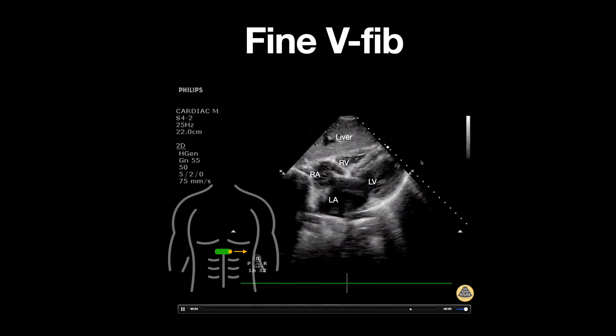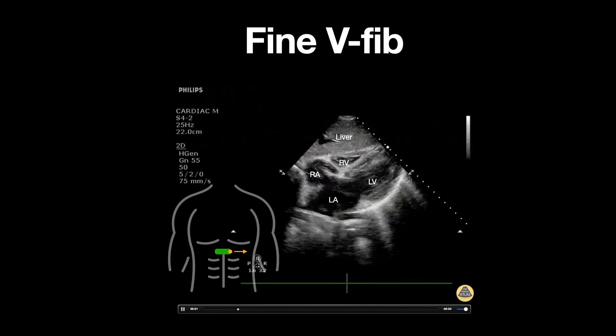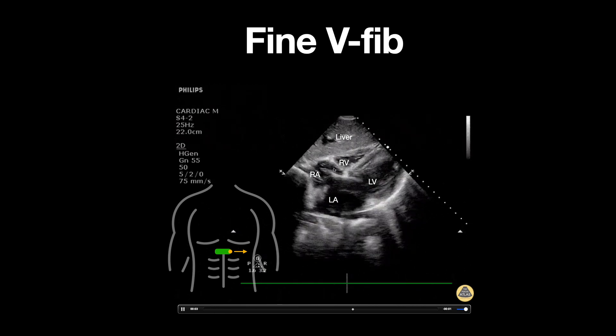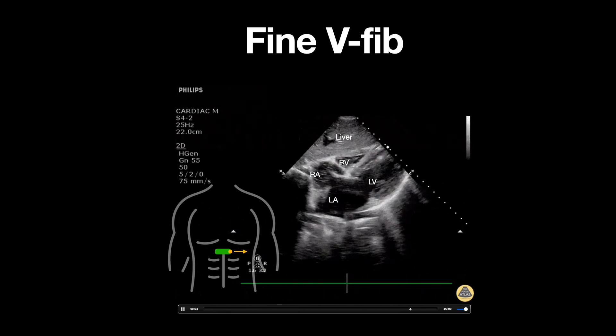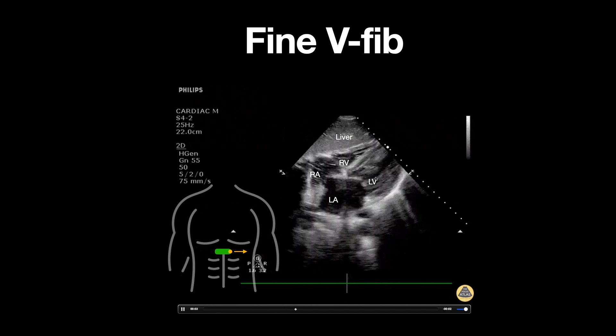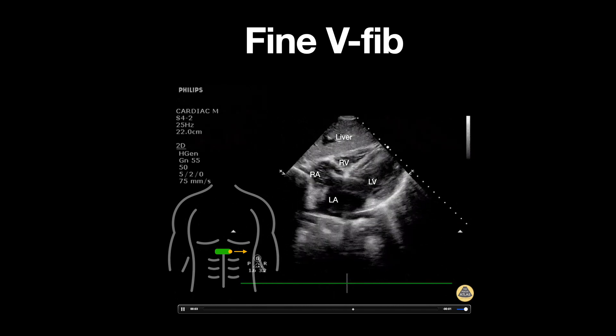The chambers of the heart can be visualized and are annotated here: the right atrium, right ventricle, left atrium, and left ventricle.